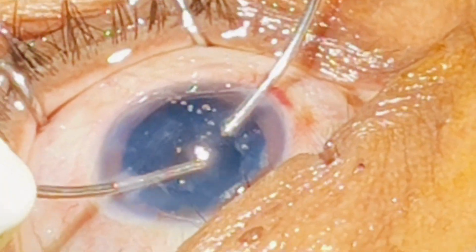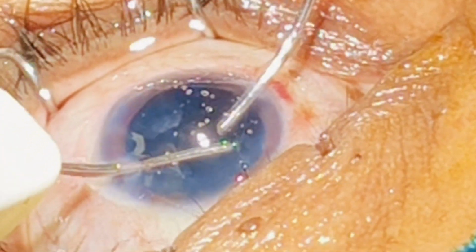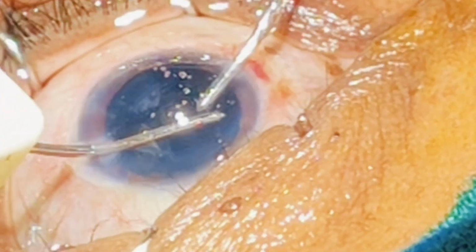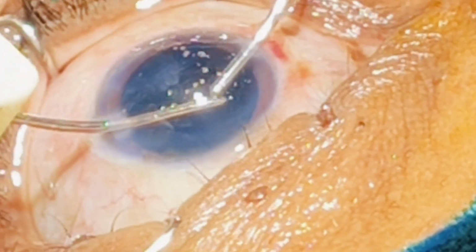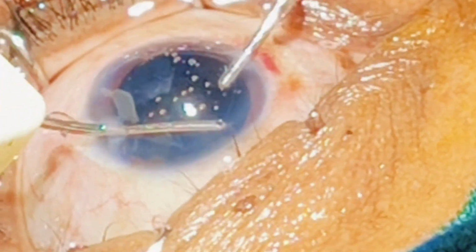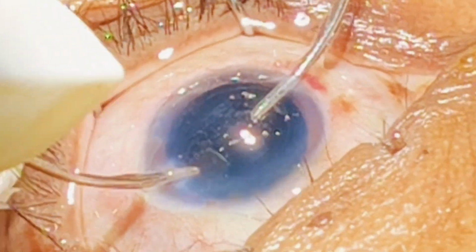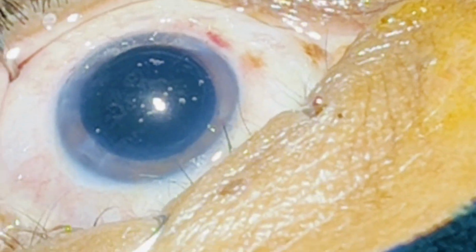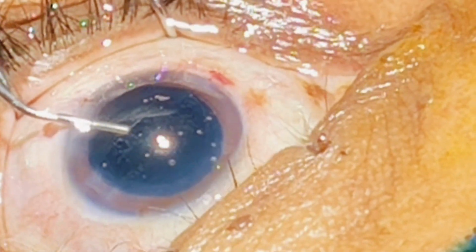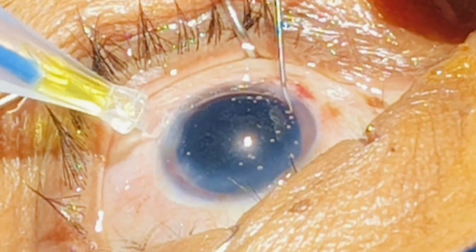See, I'm just doing swiping movements and bringing them to the center. I'm not aspirating them at the periphery, bringing them to the center, and then aspirate. Keeping only in the irrigation mode, I did a little polishing of the posterior capsule to remove the PCO part, the opacities. We'll inject the IOL.